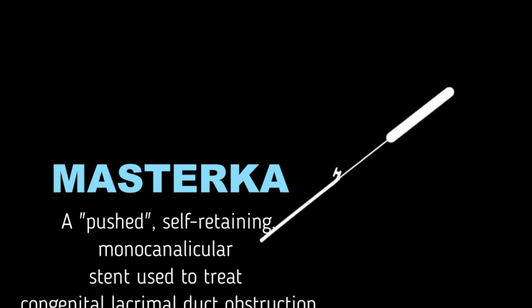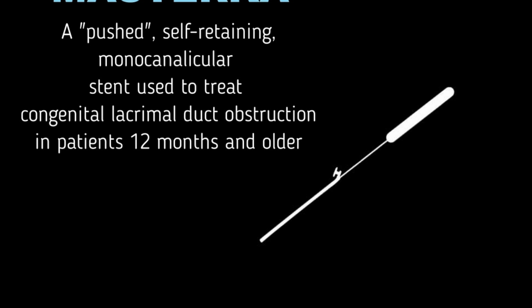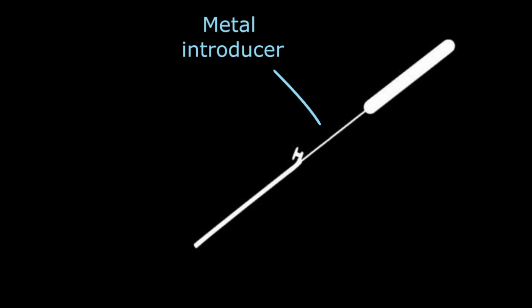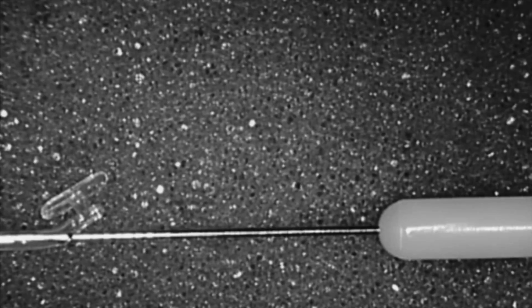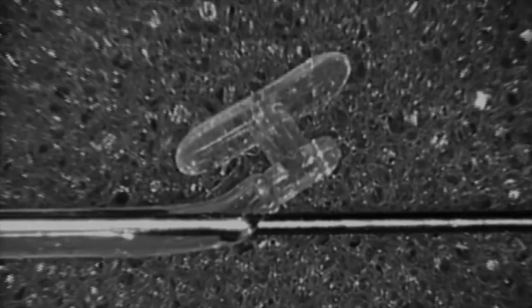The Masterka is a pushed, self-retaining monocanalicular stent for nasolacrimal duct intubation used to treat congenital lacrimal duct obstruction in patients 12 months and older. The Masterka has a metal introducer located in the lumen of a silicone stent. The introducer is not an extension of the silicone stent as seen in more conventional type stents. The introducer facilitates insertion of the stent and is completely removed once intubation of the lacrimal passage has been completed.